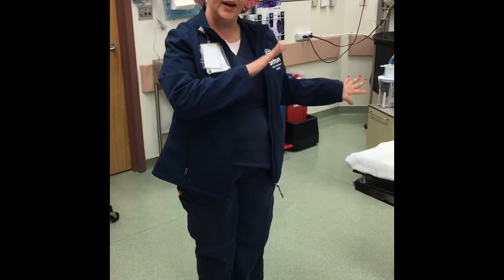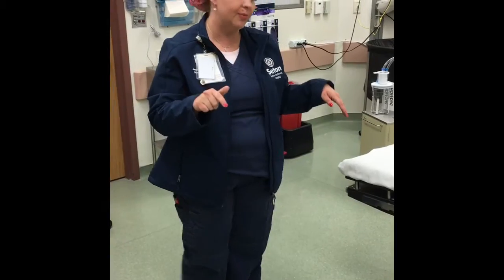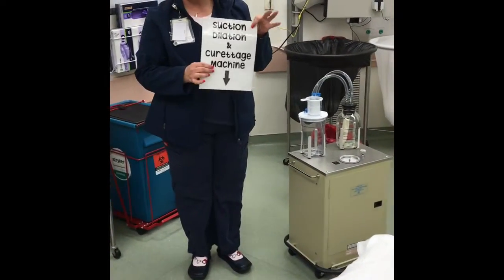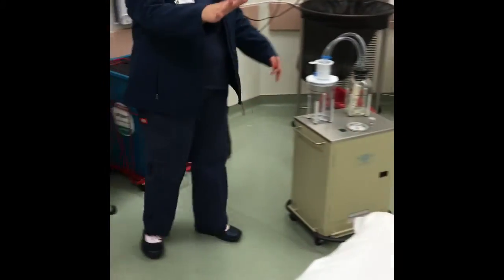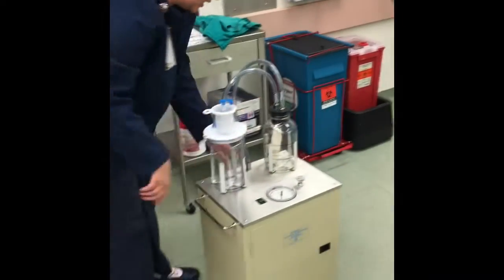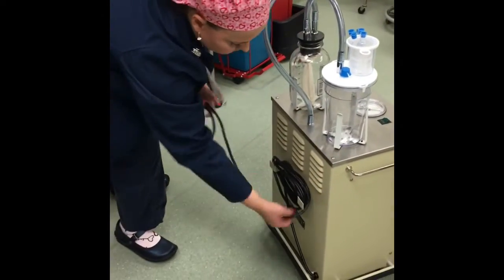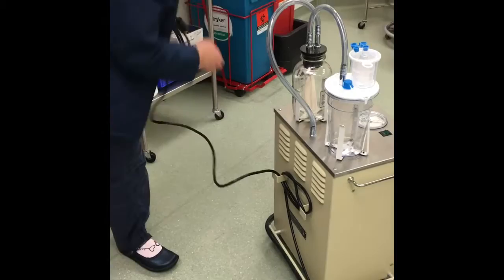Through getting your bed all ready at the beginning, you would also get your suction machine ready, which is located in the same area as your cart, and there's a sign. And you would bring it into the room. You want to have it close to the foot of the bed, so I generally try and keep it at the end. And then there's a cord back here that's just wound up, and you just want to unwind it and then plug it in.